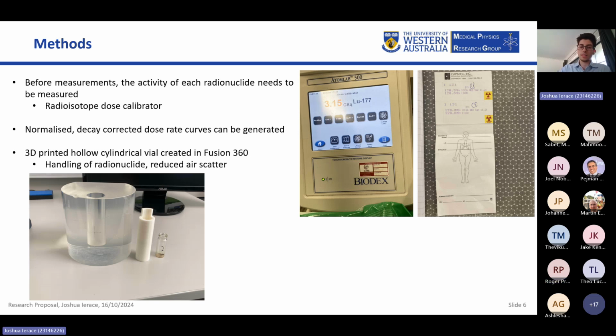Yeah, so my understanding is that NUMEX just provides the numbers, and then it's up to the medical physicist to interpret the restriction periods. Whereas software such as Dawn actually has restriction periods, like don't go to work for 5 days, or don't sleep next to a spouse for a week. But as far as I know, I don't think NUMEX currently has restriction periods. It just has the numbers.